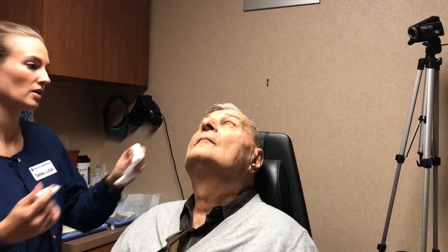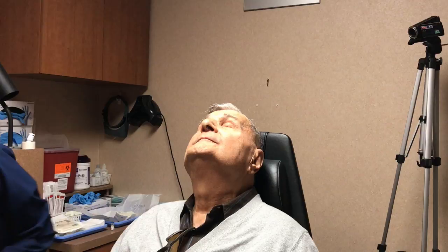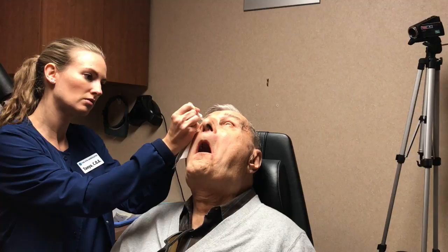We're going to do your second drop, Mr. Merino. Good, and just rest the eye — we'll do another one in about three to five minutes. We're going to put in your third drop now.